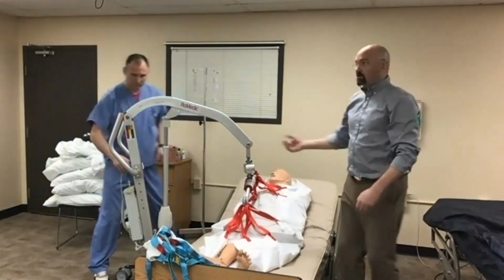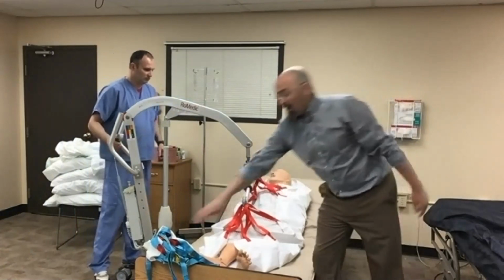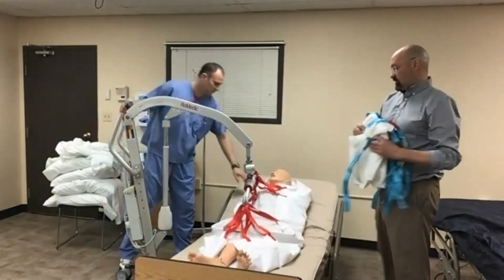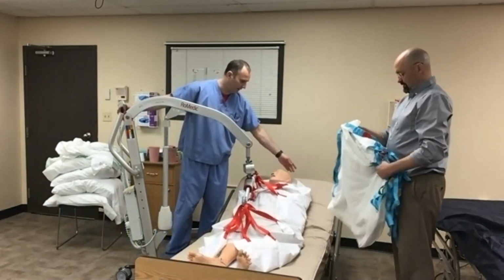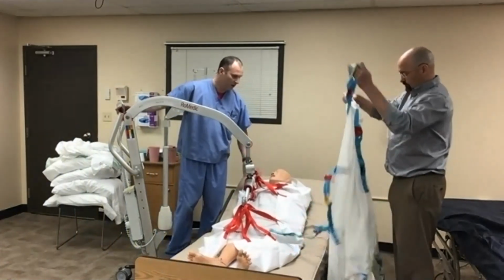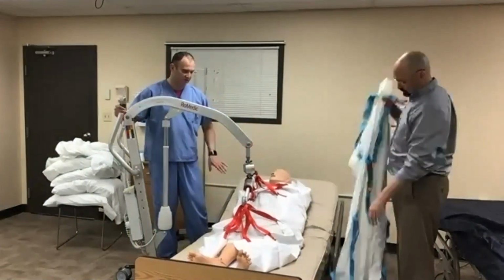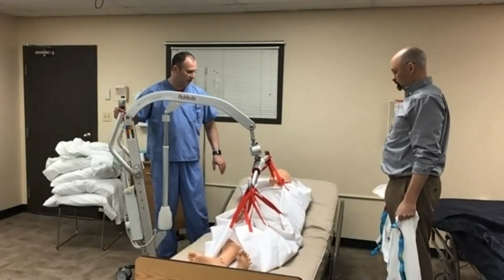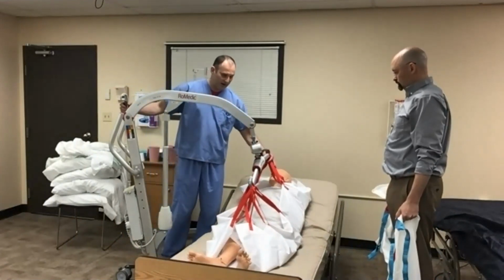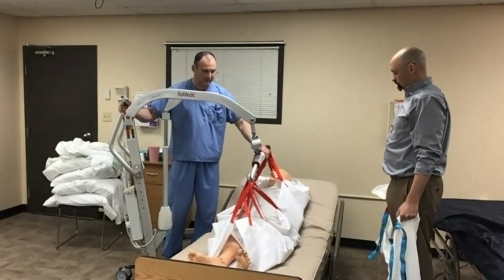So we're going to now use our ceiling lift system or our floor-based lift and lift that patient up and apply a second repositioning sheet underneath that patient. But again, there would be other people here to help manage the patient's head and airway. We elevated the head a little bit just for positioning purposes as the patient gets lifted up. When I start to initiate the lift, I'm going to let tension get on these straps, and I'm just going to make sure I check each one to make sure that they're not slid out of place.